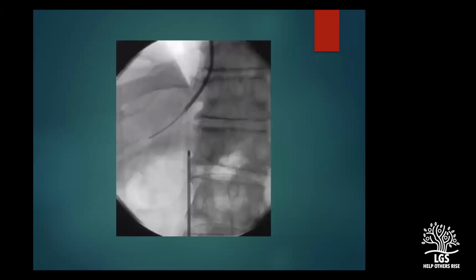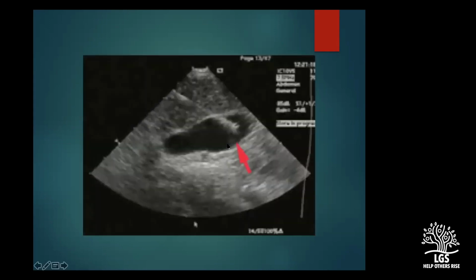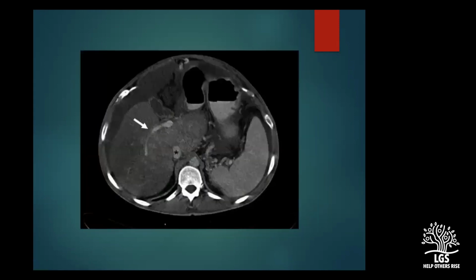And there are various techniques. I would probably skip this, but just to show the advancement in technology, there are various techniques that we use for TIPS. One is the ultrasound guidance. If this is the portal vein that you're seeing, we can puncture the portal vein, and where the star is, is the cava. In the DIPS procedure, we need to connect these two up, cava to the portal vein. It is very difficult to aim at the portal vein coming from the cava. So what we can do is use a retrograde approach.